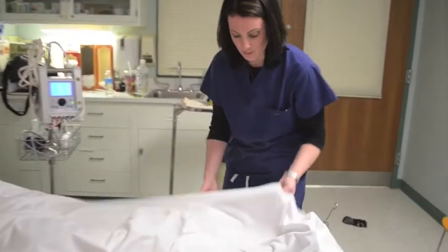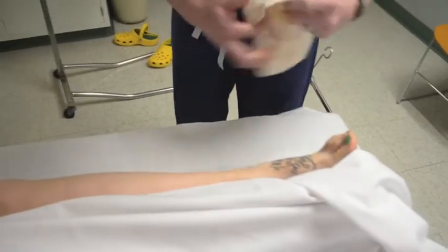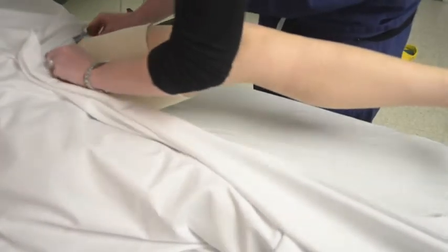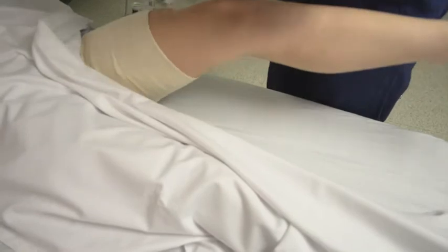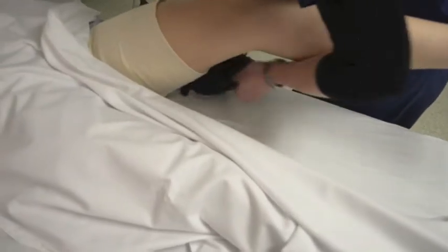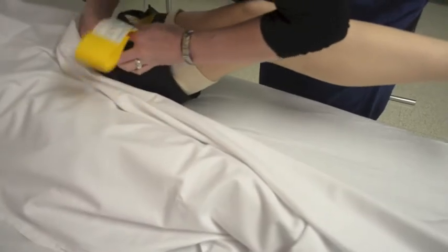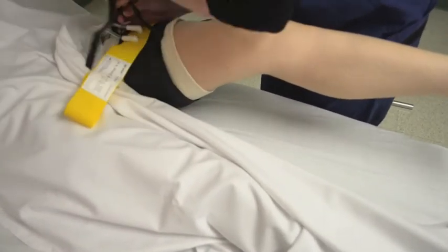Now for the demonstration. This patient's medical history does not contraindicate the use of a pneumatic tourniquet. First, a protective barrier is applied on top of the extremity where the tourniquet will go. The inflatable cuff is then securely wrapped around the extremity, making sure that the protective barrier covers the inflatable cuff.